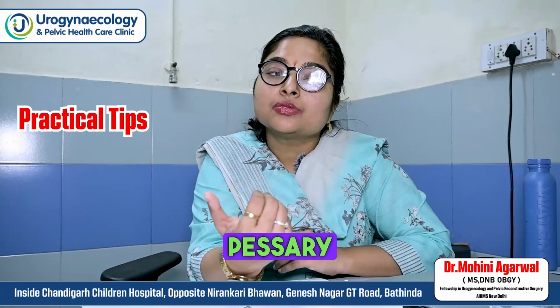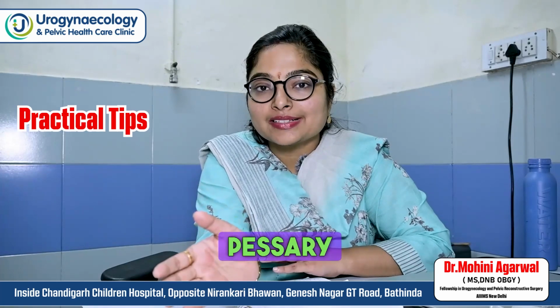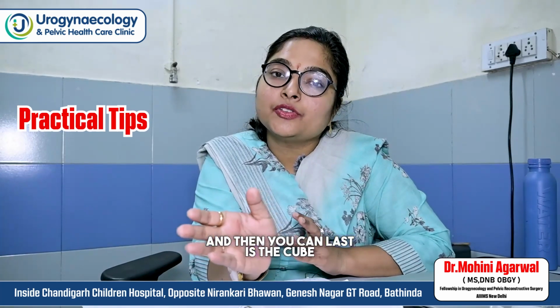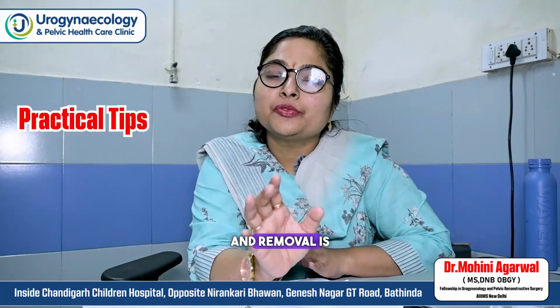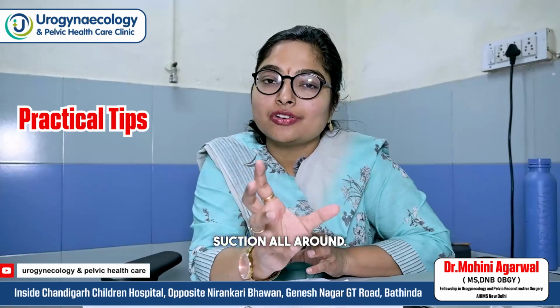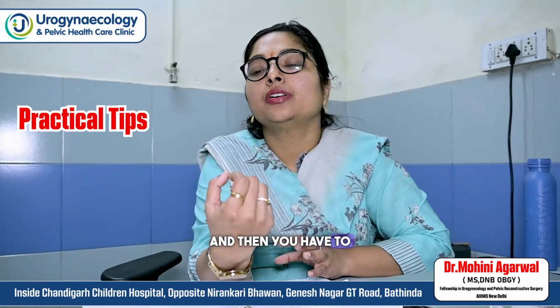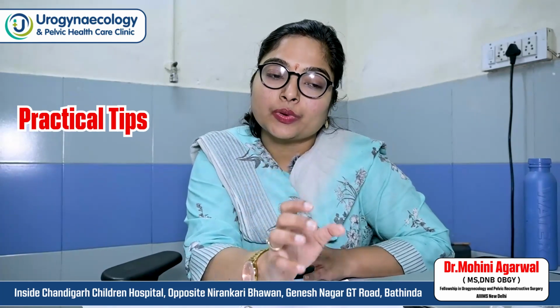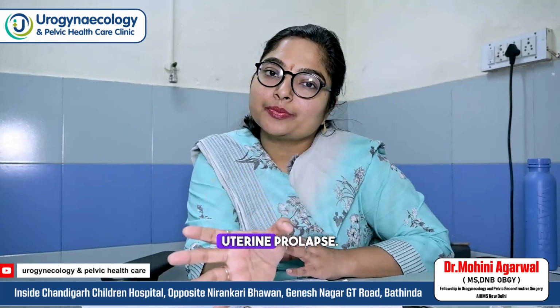The Gellhorn pessary has good support, then you can shift to the donut pessary, and last is the cube pessary, because the cube pessary requires daily removal, and you have to teach the patient how to remove it, because it works by creating suction all around. First you have to release the suction from the vagina, and then you pull out the cube pessary. So these are the clinical tips for cases with and without uterine prolapse.